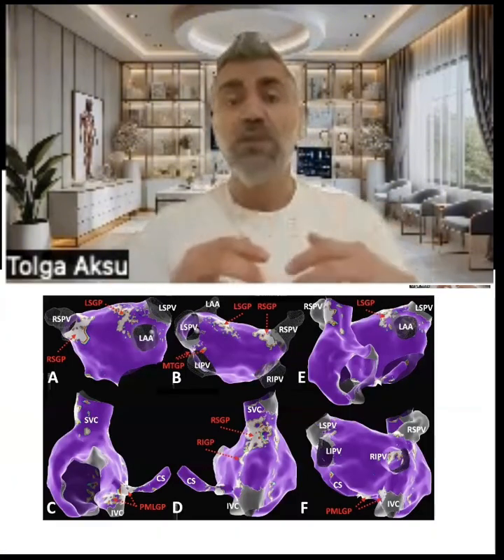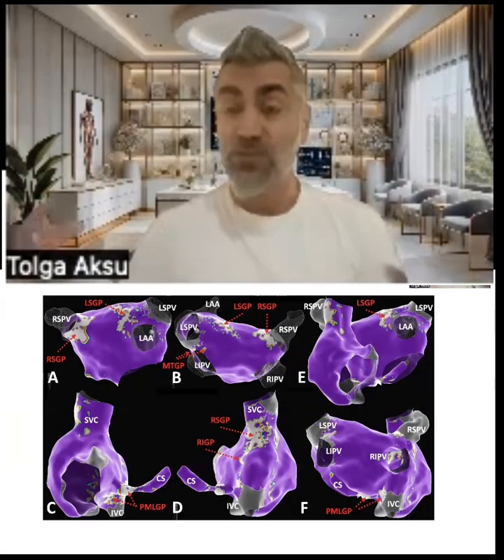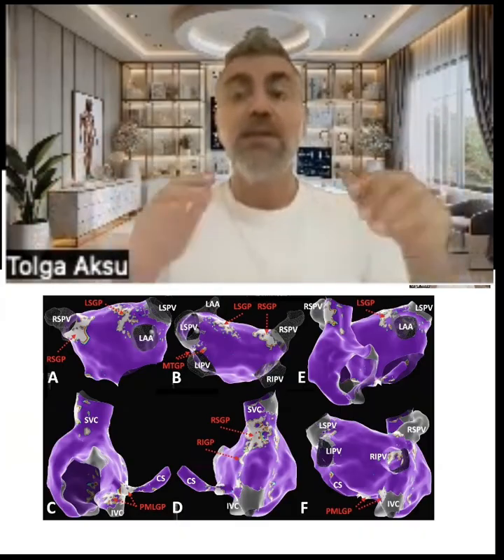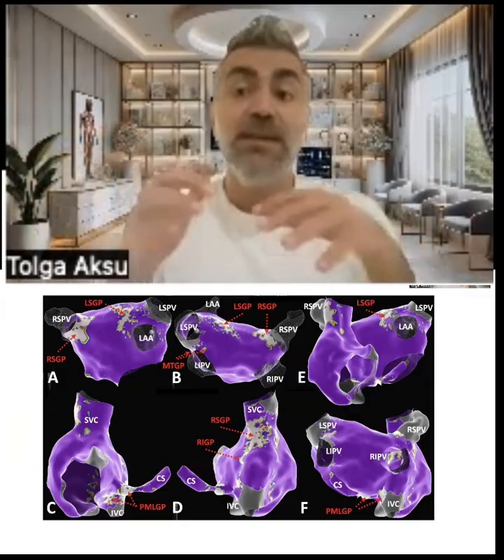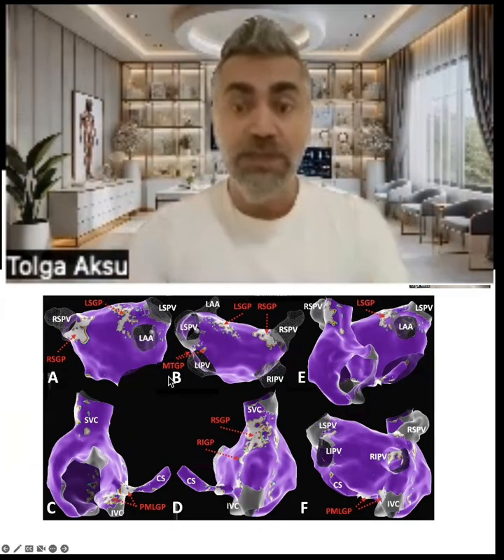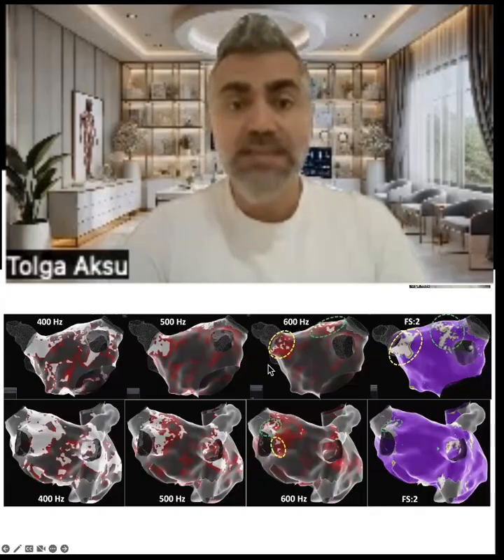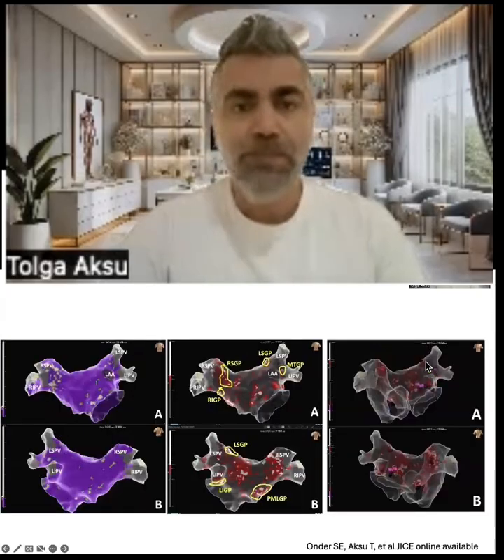And recently we tried the combination of fractionation software and peak frequency software. And actually in peak frequency software, the system tries to show us maybe more than 300 hertz electrogram area, and with the combination of fractionation software and peak frequency software with different hertz selection, you are seeing the localization of GP very, very clearly.